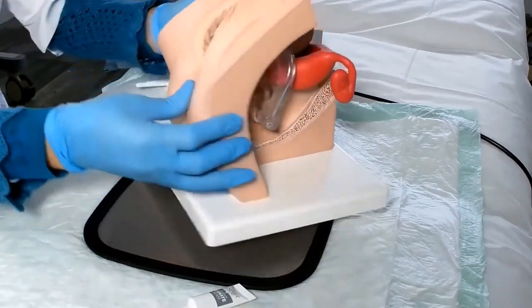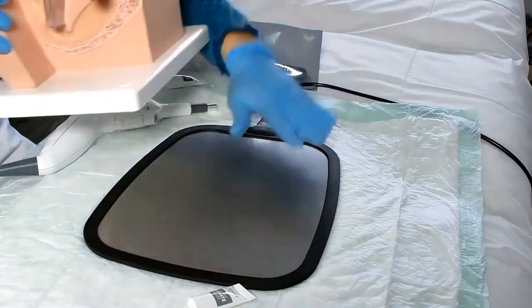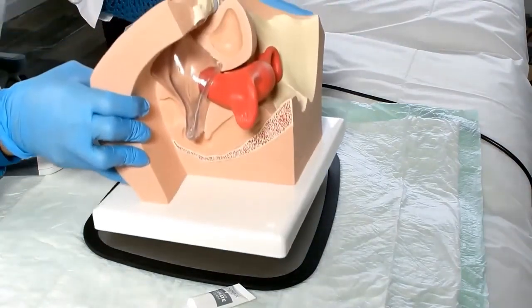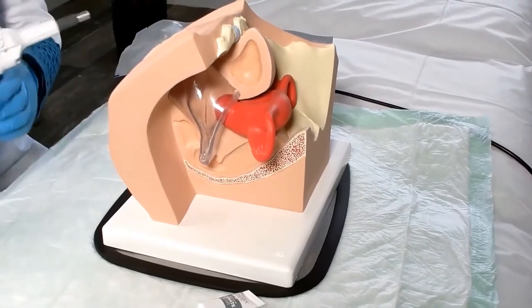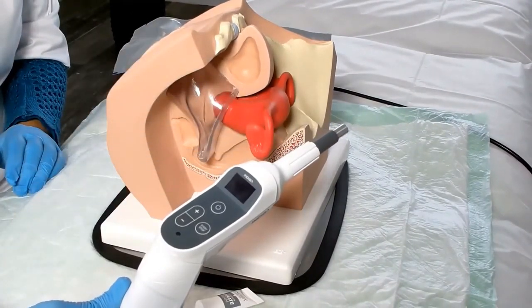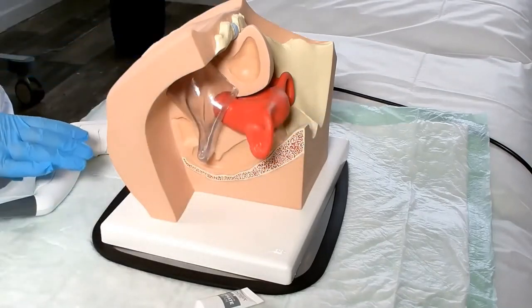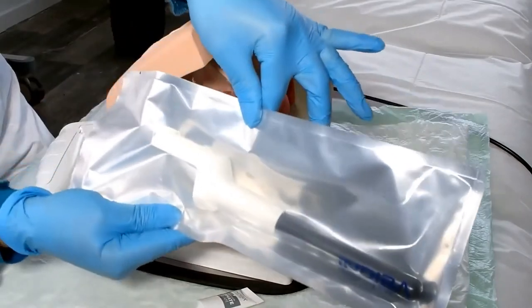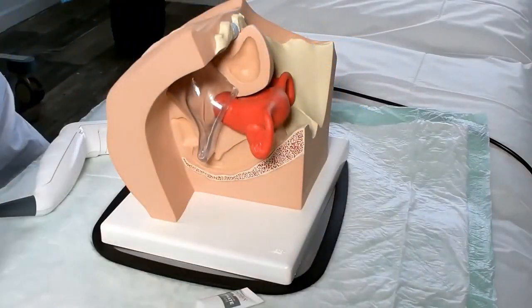In this case we will work with an anatomical model. Place the return plate as close as possible to the treated area, in this case in the lumbosacral region. Ensure that the equipment is switched off or without power. Open the sterile pack with the capacitive electrode.